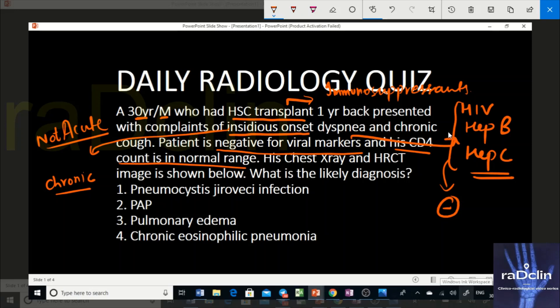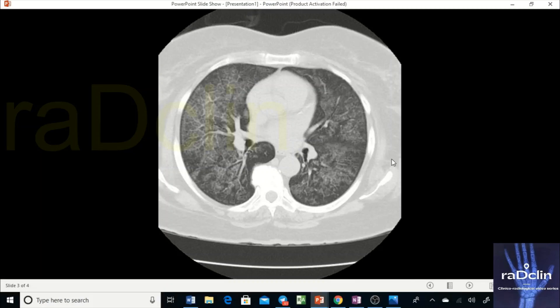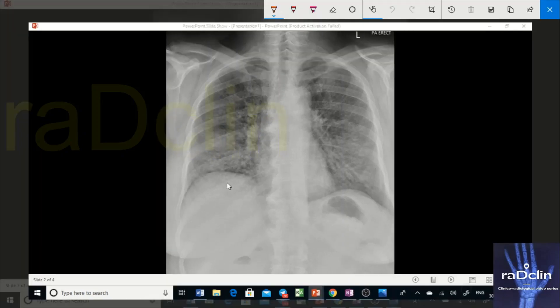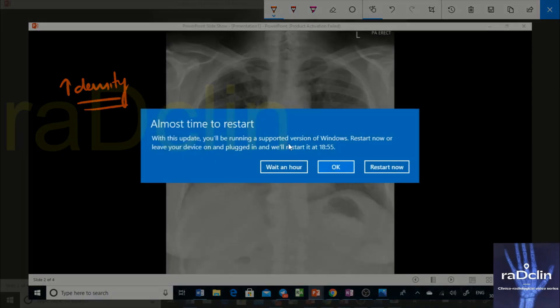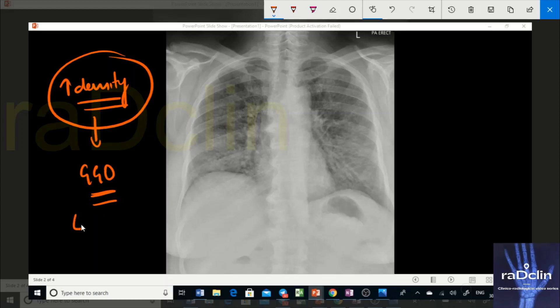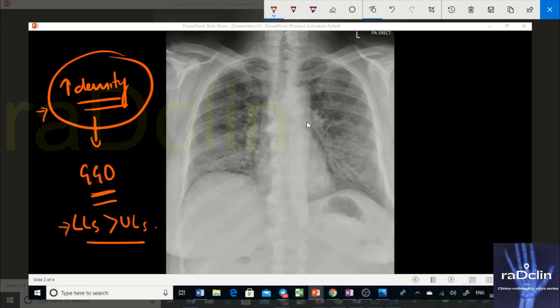Now look at the chest X-ray and the HRCT image. On this chest X-ray, bilateral lung fields show increased density — not a clear-cut consolidation, because the density is slight. It's not completely dense, not obscuring the vessels behind it, so it looks like ground glass opacity (GGO). The involvement is primarily diffuse, but lower lobes are more involved than upper lobes — a slight lower lobe predominance. There is an increase in density and other structures appear quite normal.